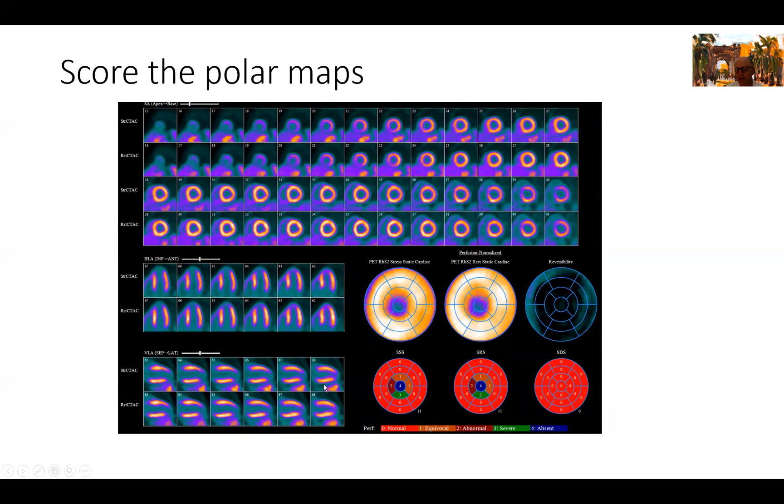We go to coding these images. You can see here we can disagree slightly on whether we call this 2 or 3, 1 or 2, but we can also all agree that we have no uptake in the apex and some of the periapical segments. This is how we finally agreed on calling it by semi-quantitative analysis with a summed stress score of 11, summed rest score of 11, and summed difference score of 0. Summed difference score implicates or indicates ischemia. So there is no ischemia here. We just have a fixed defect.